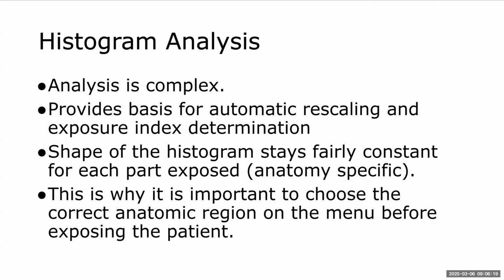So histogram analysis is complex. It provides the basis for automatic rescaling and exposure index determination. So the analysis of the histogram is how the automatic rescaling is done, and determining the actual exposure index, whatever that is, whether it be an exposure index, that should say probably indicator would be a better word there, because indicator is sort of the broad umbrella that a lot of other things fall under, like S value or EXI or EI or EIS, all of those different things that we'll get into here in just a little bit.